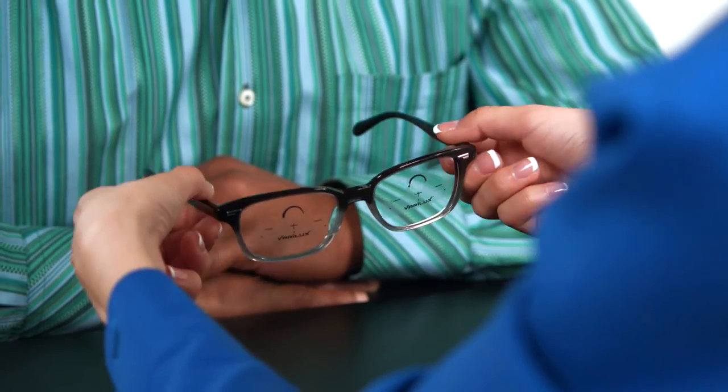Once you've verified the prescription is correct, you're ready to fit the glasses on the patient. With the lenses marked or using lens masks, place the glasses on the patient's face.